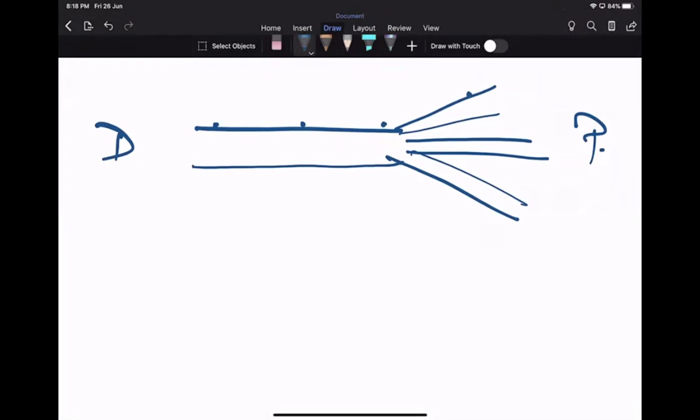Now, suppose a stricture is happening here, your S1 stricture, and the patient is symptomatic, even though it's just one branch. Your prognosis is going to get worse and worse as you go proximally because there are issues like the length of your endoscope, the angulation of your branch, and your stent actually reaching the stricture to prevent any future recurrence.